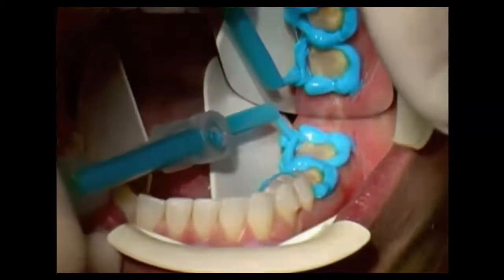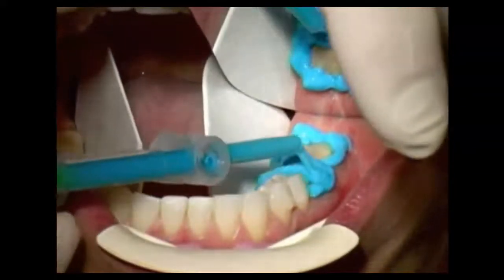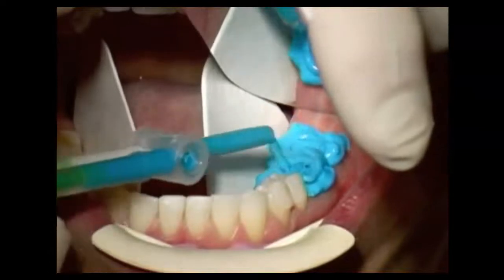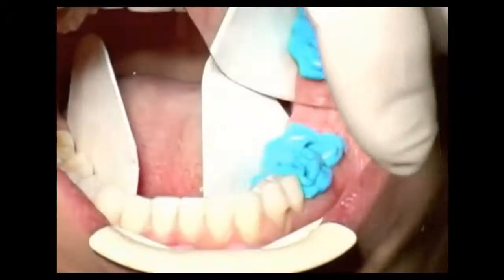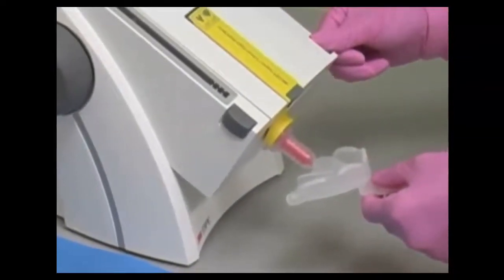Notice the use of dry angles in here. Again, we want to ensure that the area remains dry. We don't want to get any moisture in there that can interfere with the final impression. We want it to be as accurate as possible.